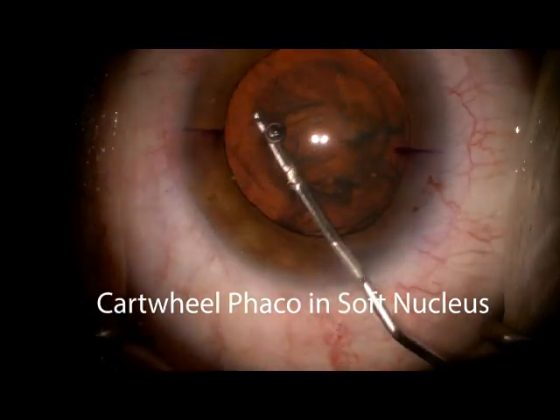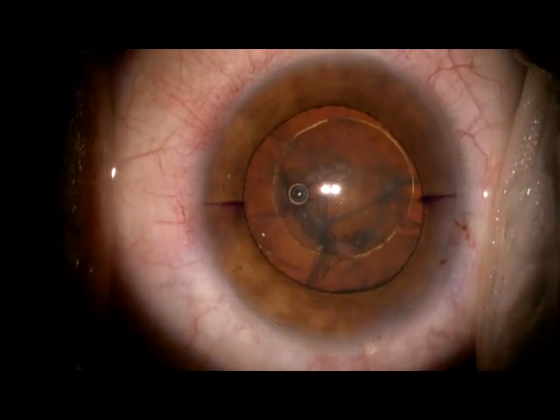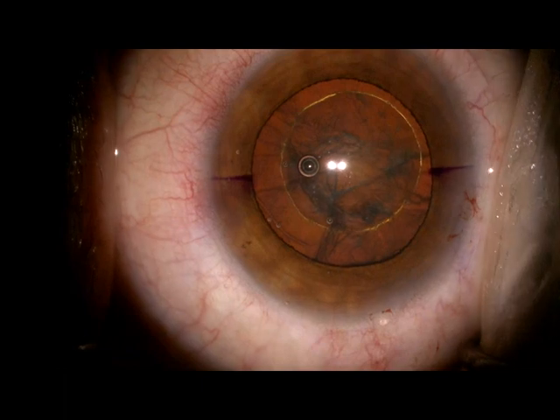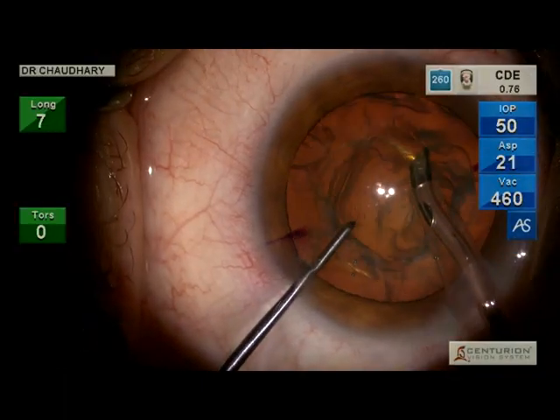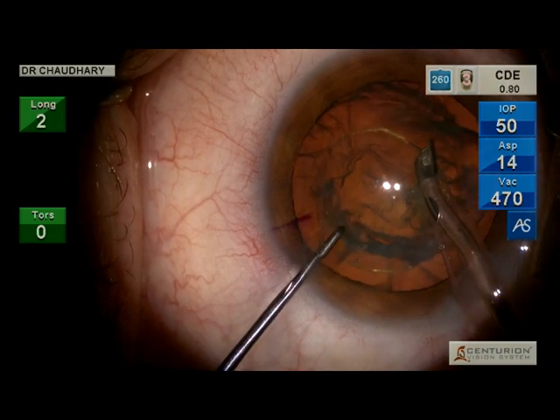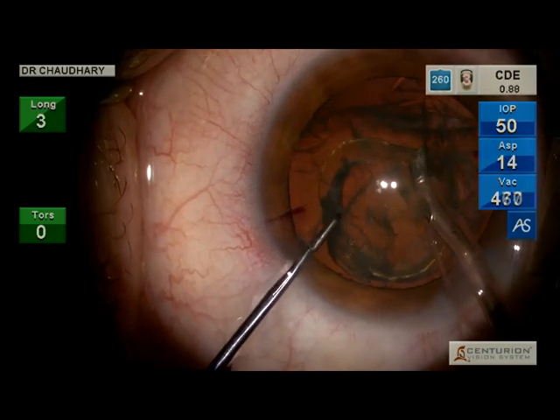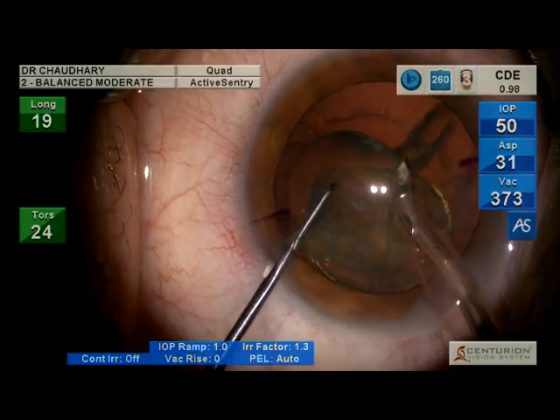Cartwheel FACO in a soft nucleus is a useful technique. You place the FACO at the edge of the nucleus and it appears as if the nucleus unrolls itself into the tip of the FACO.